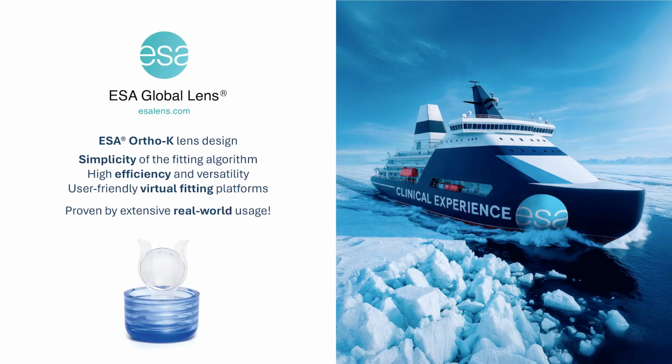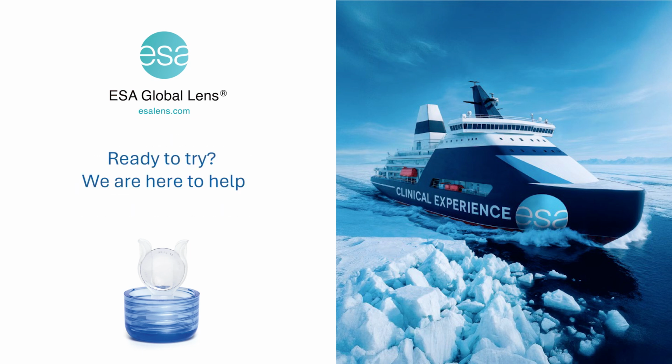This concludes our training course. We hope that the simplicity of the ESA lens fitting algorithm, the high efficiency and versatility of this unique design, and the availability of user-friendly virtual platforms for lens selection will attract your attention and enhance your clinical practice. We encourage you to experience the results firsthand by fitting ESA lenses to several of your patients. Our team is fully prepared to provide the clinical support and guidance you need to ensure success. Best of all, no initial investment is required.